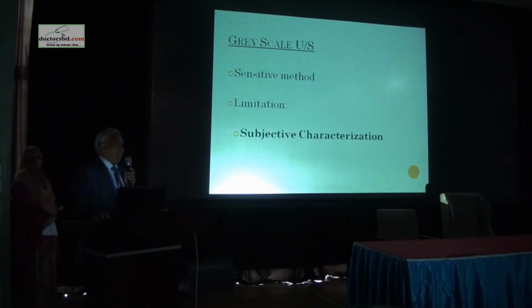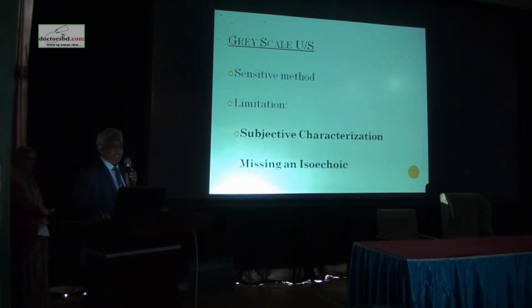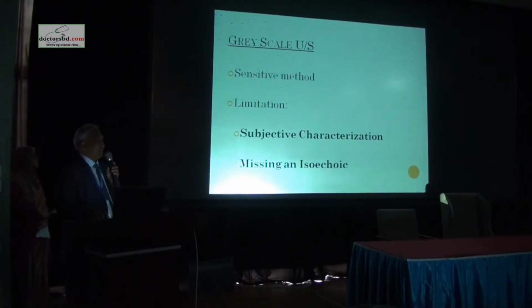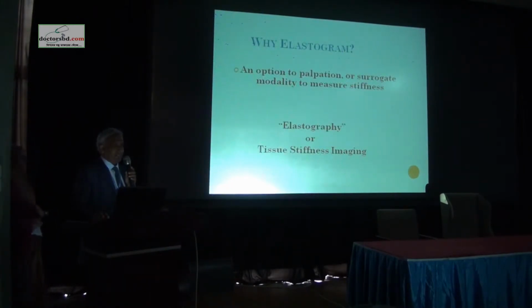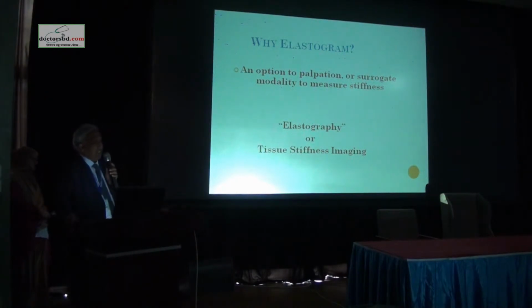But there are certain limitations inherent to gray scale ultrasound as well. The subjective characterization depends upon the experience of the operator, and isoechoic lesions are sometimes missed on gray scale ultrasound. So again you have limitations of gray scale ultrasound, and that is why elastography was found to be an option to those limitations.